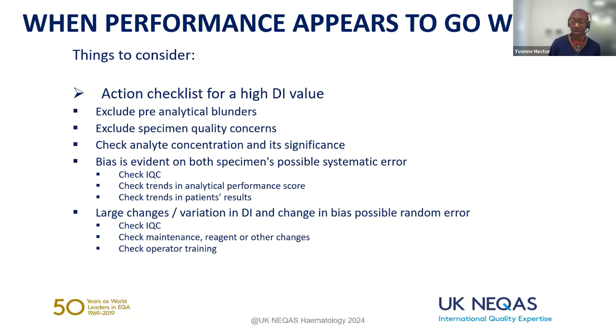Sometimes, and we've seen it happen, new staff have come in and they haven't necessarily read the instructions correctly, so they're not necessarily running the samples, for example, in the right mode. So that's always a good thing to go back to, to make sure the person handling the sample does know what they're doing in line with our instructions.